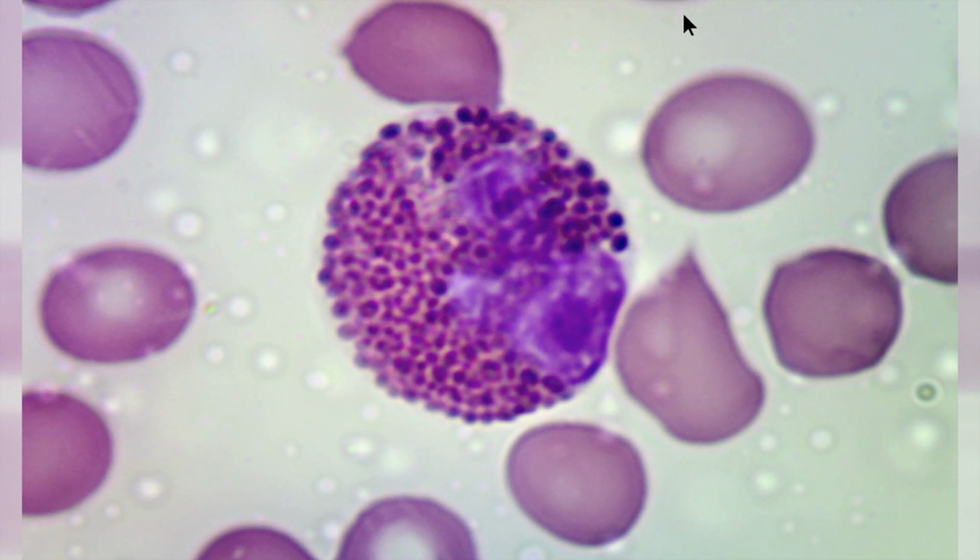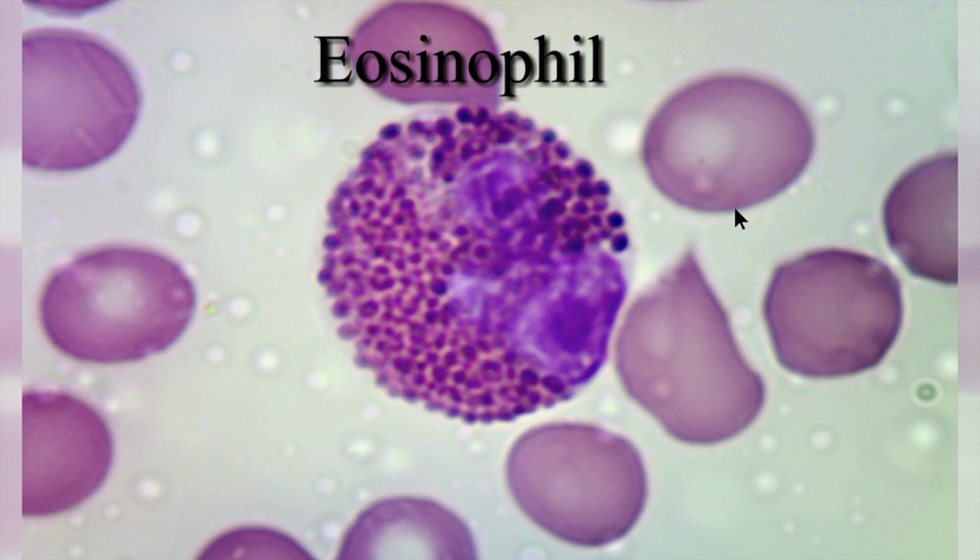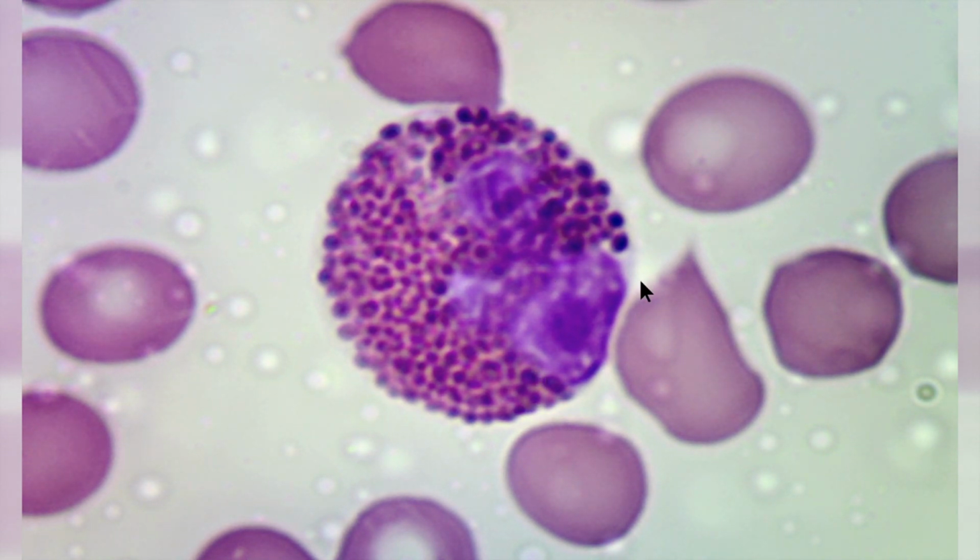The white blood cell that you have in the field is an eosinophil. And you can notice the nucleus. In this case, the nucleus is segmented, but most of the time the nucleus of eosinophils may be bilobed. However, the distinct characteristic of eosinophils is their granulations.